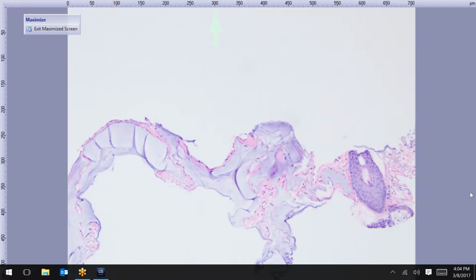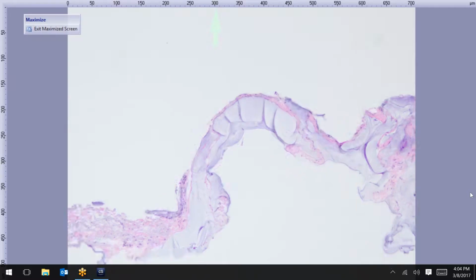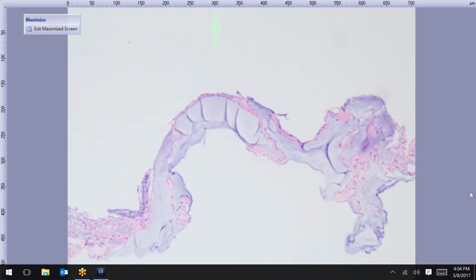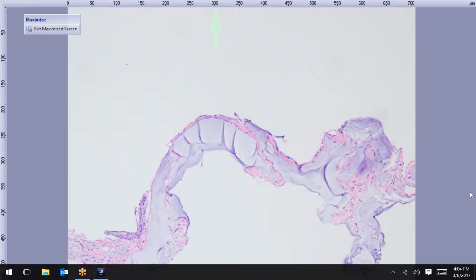So this happened to be a Juvederm injection. I don't know how long ago they had the injection. It was actually, I think, some time ago, and then somehow this papule kind of presented itself later after the fact. So yeah, this is basically a Juvederm injection, hyaluronic acid. If we were to stain this with Alcian blue or other mucin stains, it would stain positive. I've seen a few of these every now and then. Occasionally we'll see them with a granulomatous reaction, which is kind of a problem. So okay, good, Juvederm.